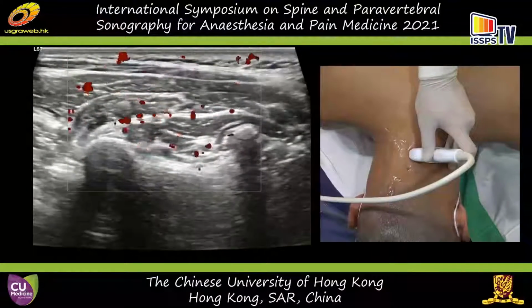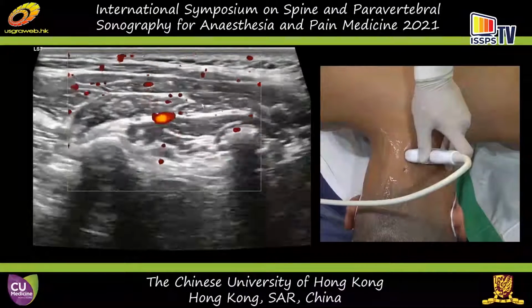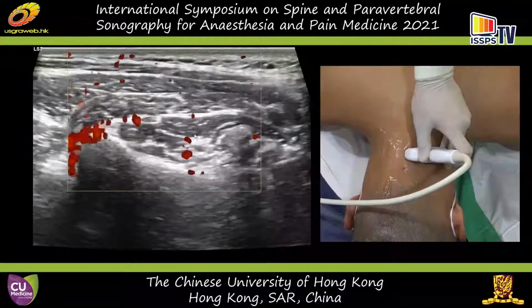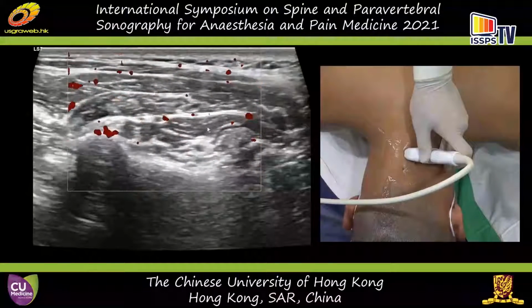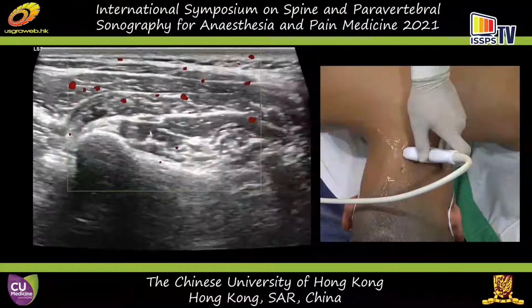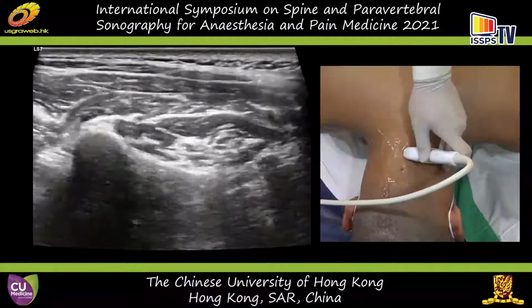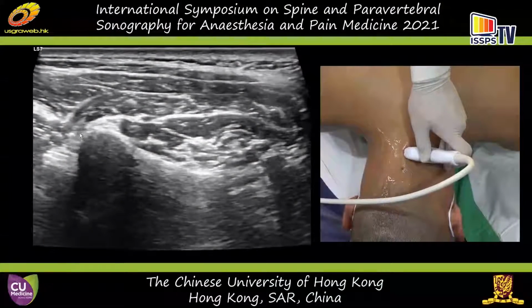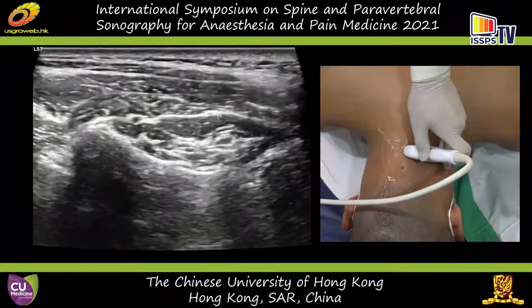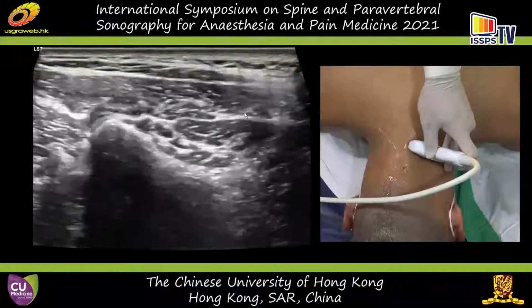And that's the artery separating the semispinalis capitis and the fascial plane for all this deeper muscle like the semispinalis cervicis and the multifidus muscle. And remember, this bifurcation plane is also for all those medial branches trying to go midline. The medial branch is going to go inside this fascial plane. So that's another site you can see the medial branch.